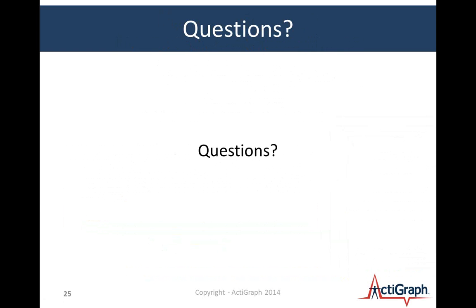Okay. So we'll just pause briefly for another section for questions before we get into group initialization. Okay, so let's see what we got. So I had a question from Christelle. Can you repeat the part about creating the log, the children on the playground? Yeah, Christelle, I think I know what you're asking.